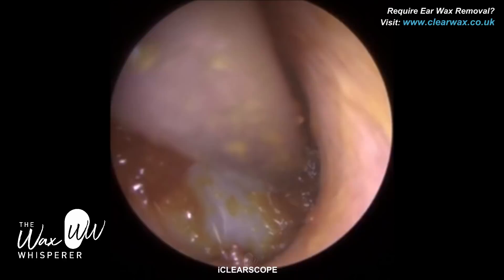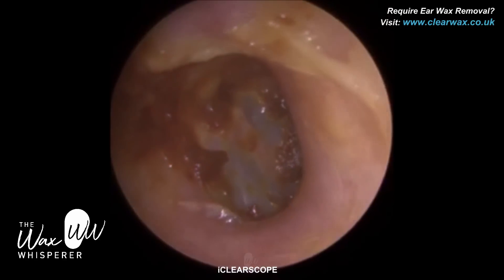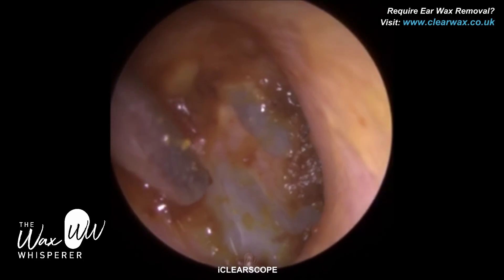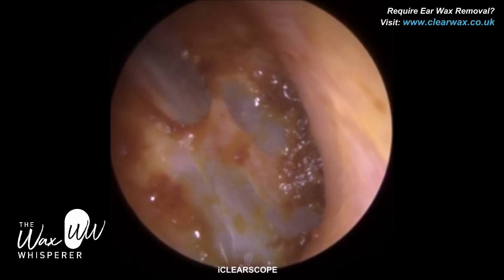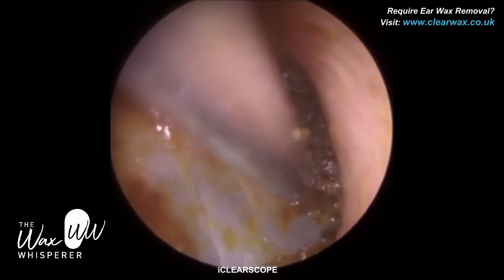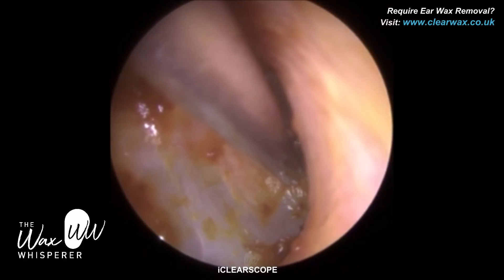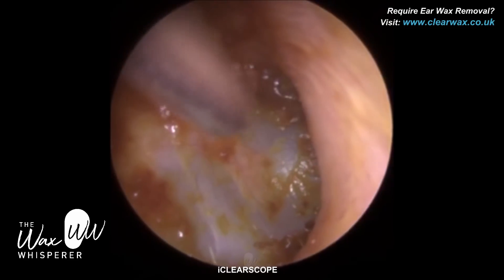Because it's shorter in length, it gave less magnification. I couldn't insert it further in the ear canal because it was taking up too much space and then impeding my right hand, which is the instrument hand. The length of the endoscope — we call that working length — and sometimes you need a good length to enable the other hand to work in front of it without both hands, or the instrument and endoscope, coming into contact. The iClearScope working length is five centimetres, so 50 millimetres, whereas the other endoscope was four centimetres, so 40 millimetres.